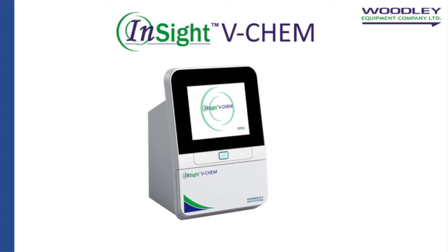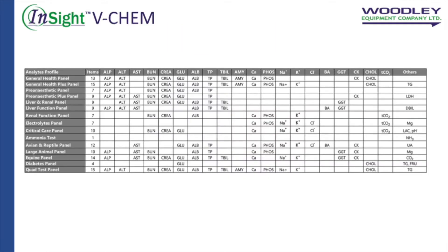Welcome to the Insight VChem demonstration video brought to you by Woodley Equipment Company. The Insight VChem is a rotor-based dry chemistry veterinary system that gives accurate results from 100 microlitres of whole blood, serum or plasma. The Insight VChem can test up to 30 parameters from a range of profiles.